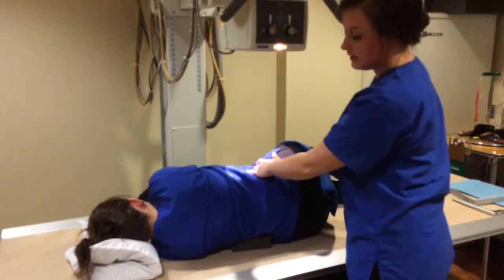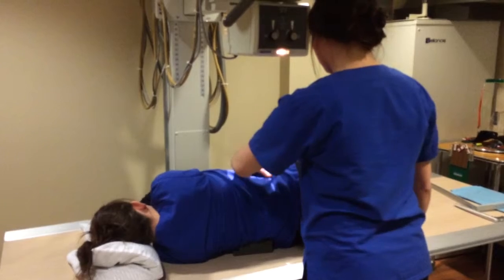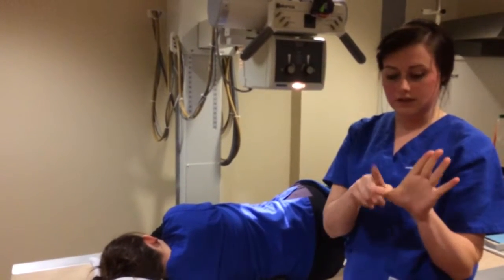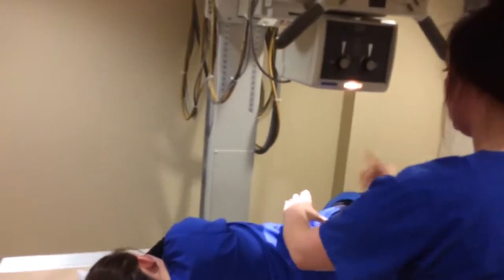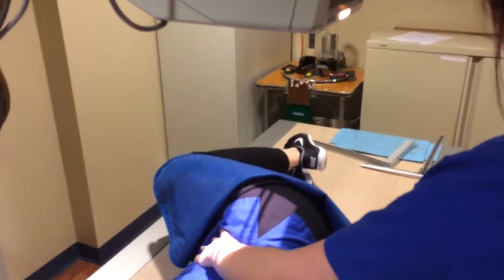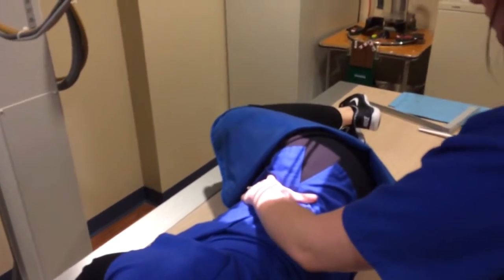And also you want it at the level of the mid-coronal plane, which you can do by taking your hand like this and putting it over the iliac crest, and right here will be the mid-coronal plane, a pretty good judgment of that. So do that, it looks pretty good.